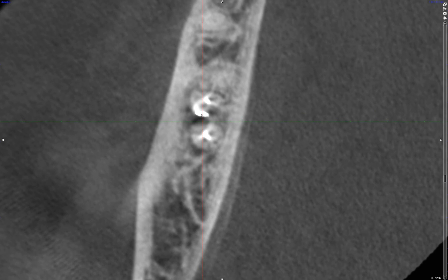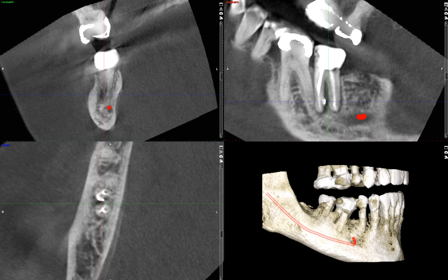It is unclear from this view how this material ended up where it is. It's not like we have a canal that is exiting laterally or a definitive perforation where we can trace where this material is coming from, but what we're seeing is a very completely separated radiopacity from the main canal.